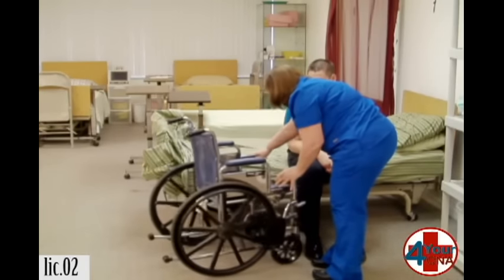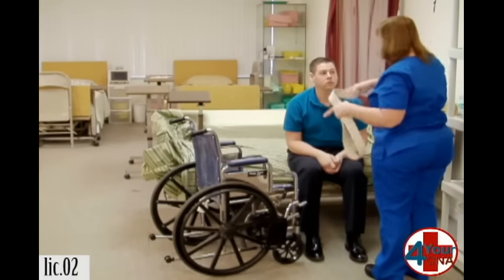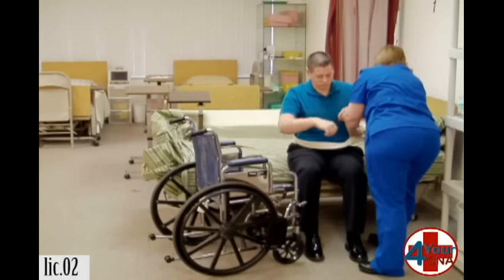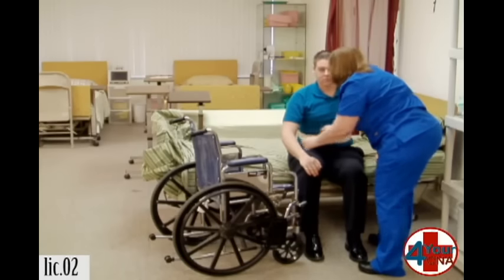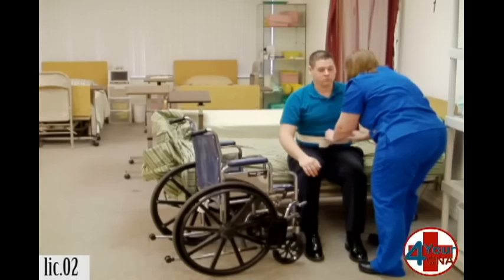I'm going to put the gait belt around your waist. This is going to help me lift you up and put you in the wheelchair, okay? Make sure I can put four fingers in there. Is that too tight? No. Okay. Are you comfortable? Yes.